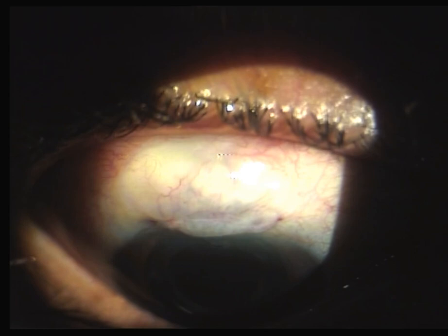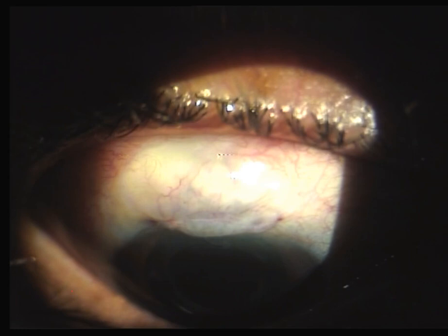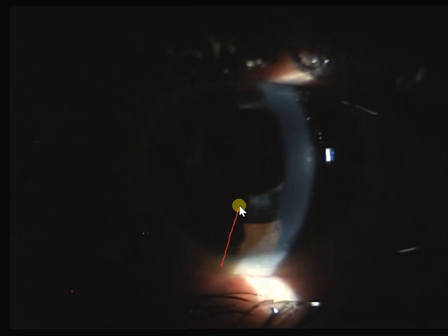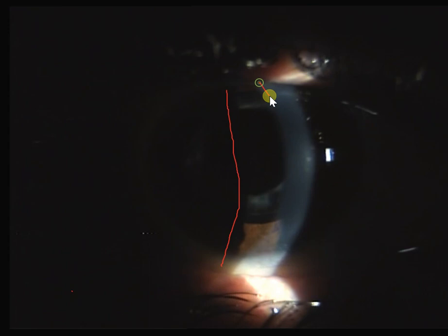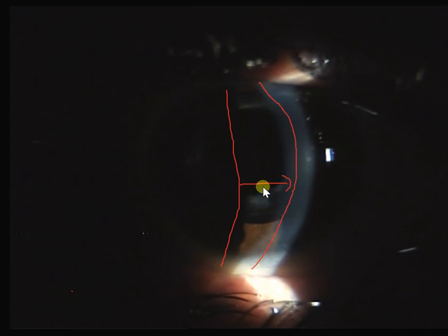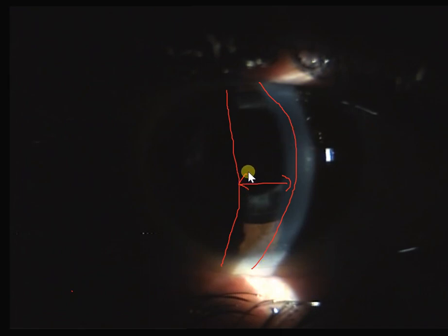Using the slit lamp, when you see a patient who has had glaucoma surgery, you need to assess the anterior chamber depth. To do that, you want to see that line over here - this is the back line and this is the front line of the slit. This is the anterior chamber depth which you are seeing in this patient.